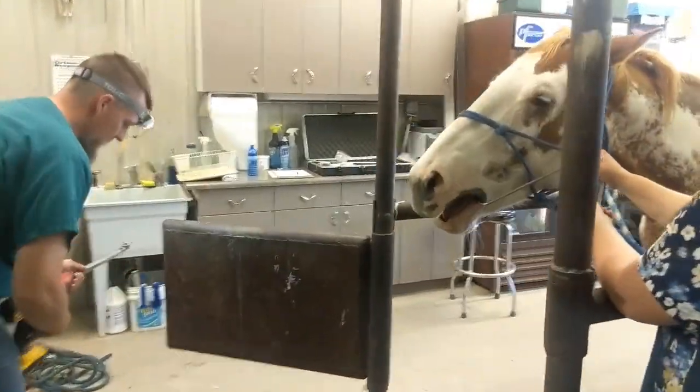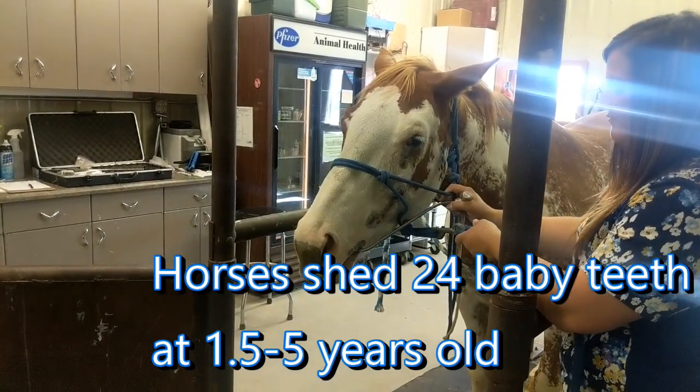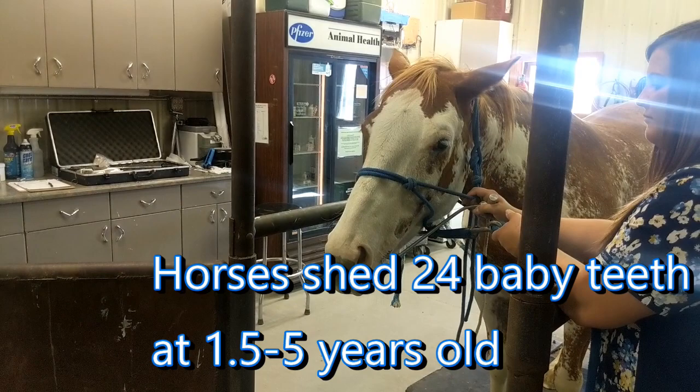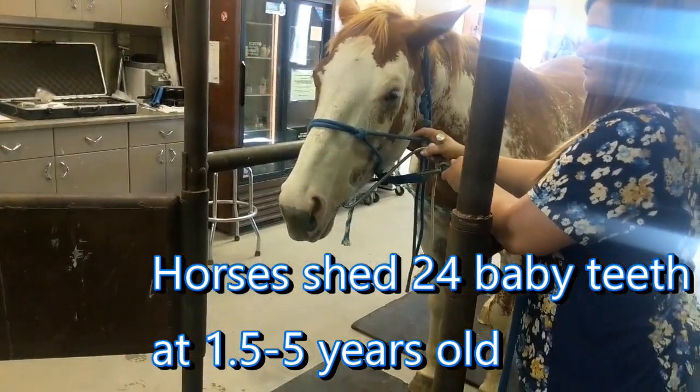A few hooks on the front? Yeah, so they get like a hook on the last inside of the whole top. Sometimes that's not a usual place to get that.